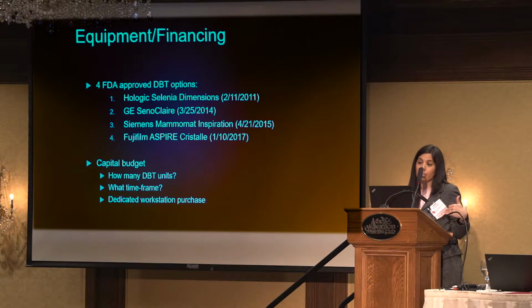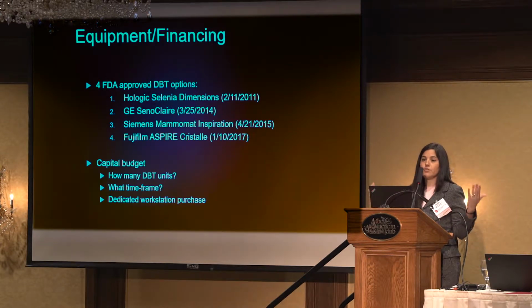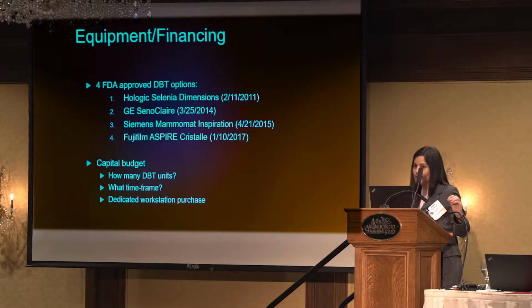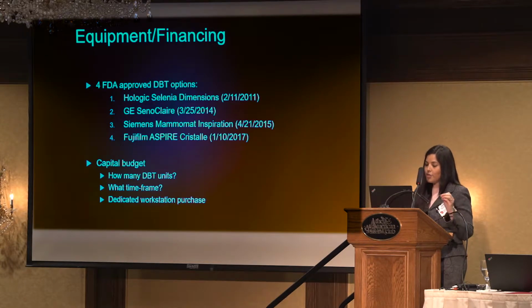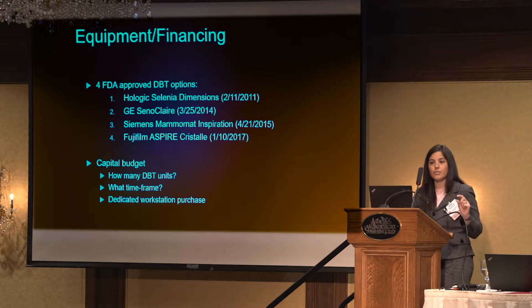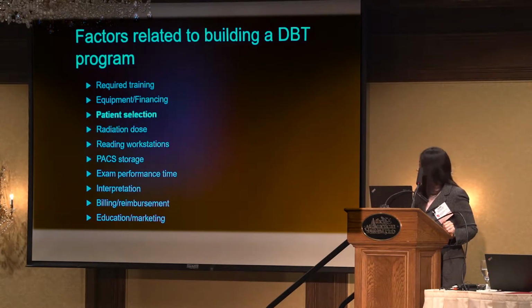So for us, in our reading room, we have 2 diagnostic radiologists, plus fellows, plus a screening radiologist. So we would need like 7 or 8 just at our mothership reading workstations, which would add to the cost of whatever you're considering. It's really tough to get an accurate quote on a single unit just by cold calling, but a new unit with DBT capability runs about $750,000, and my understanding is just the add-on, if you already have a 2D unit, to add on the tomo capability is about $370,000. So nothing to shirk at.